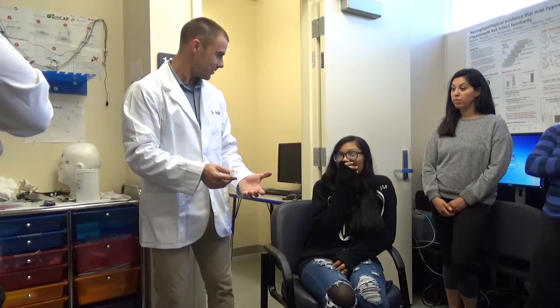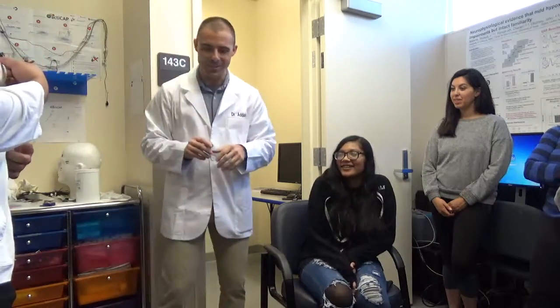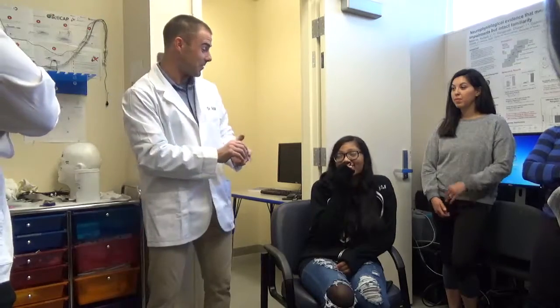You scared? No. Okay, you're scared. No, I do that a lot. Okay, cool. Well, just let me know. So, we would have this stuff prepared, and so this can be scary to people, right? This is a syringe. I'm talking about their scalp, their head, right? I mean, that's why I asked you. Was I freaking you out? No. Okay, so. I've seen scientists before.